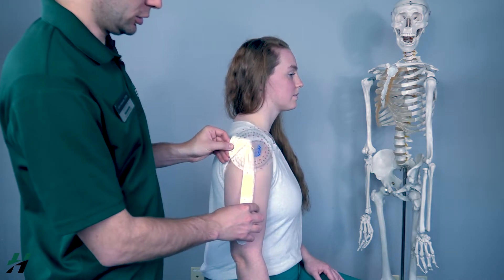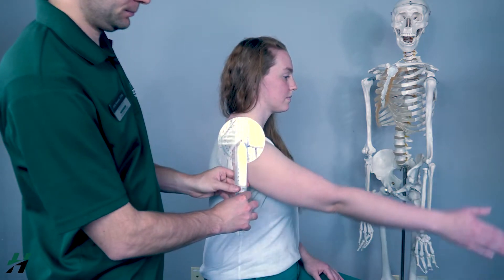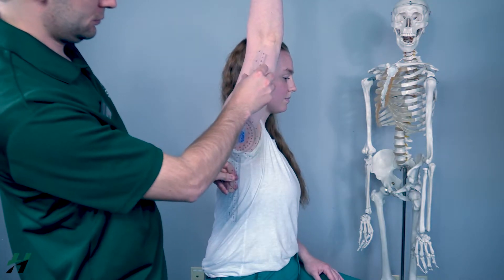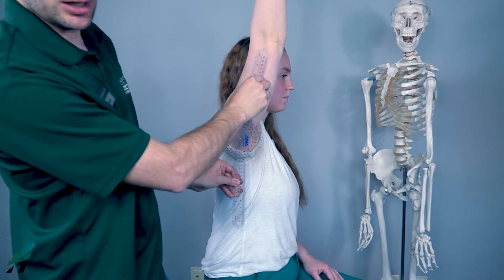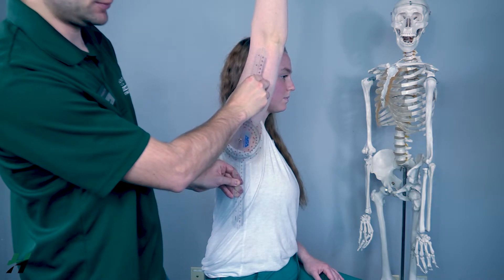Rachel, if you could bring your arm into full flexion for me. We're looking at 170 degrees of flexion.